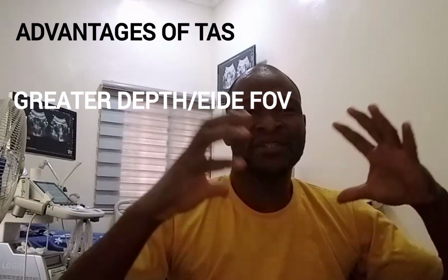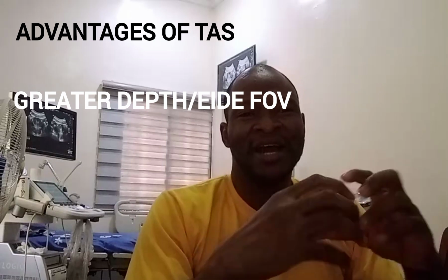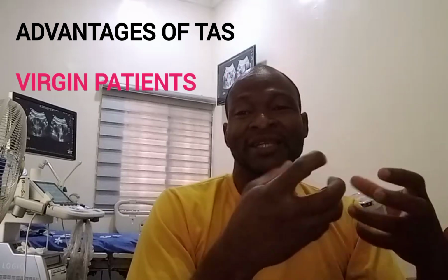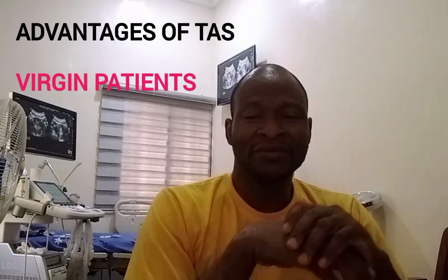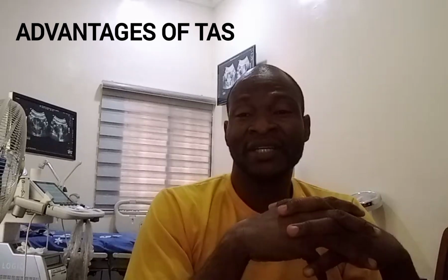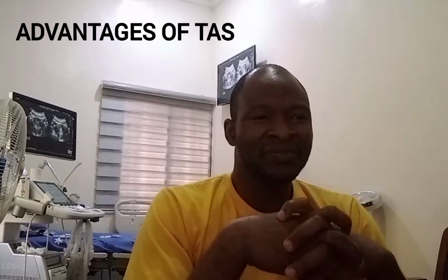You can evaluate a large mass, you can evaluate masses that are out of the range of the TV probe, and it can be used in patients with intact hymen. So in the case of females that are virgins, you don't have to do a vaginal scan. Just go ahead with your transabdominal.